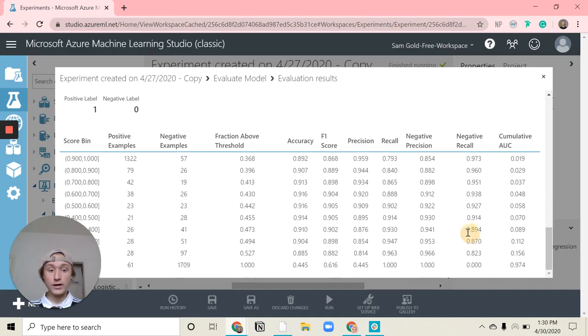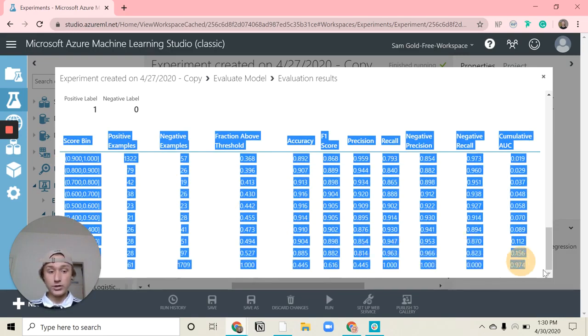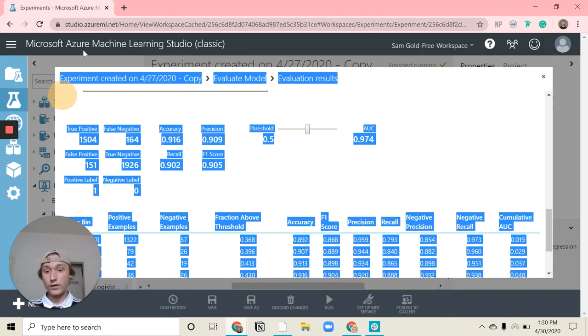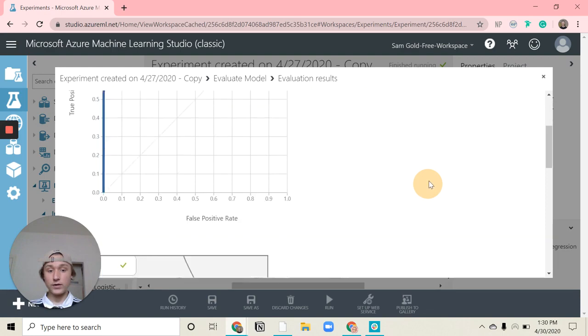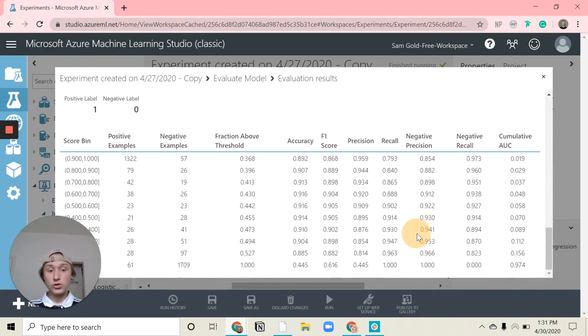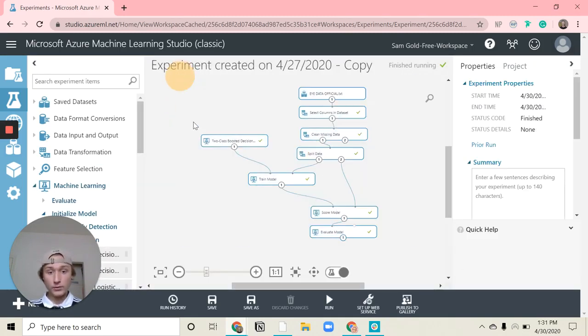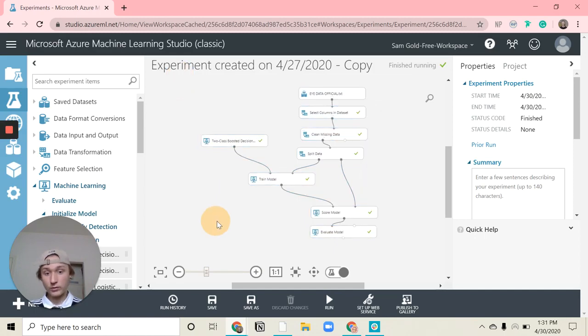That is on par with what the highest caliber machine learning models are getting right now, which is truly insane. That you can do this at home on your laptop with no coding required. I don't know how to code, but I was still able to create a machine learning model that performed at extremely high accuracy.